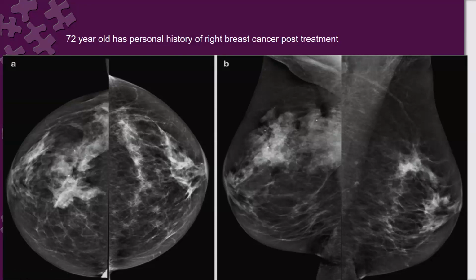Okay, this is the treated site. Okay, it is not on the treated site. This was operative or post-treatment changes. Is it easier now? It is not on the treatment site. This is a small lesion in the right image, posteriorly, a part of the treated side. Very small. Where exactly? Posterior where? You can localize, you can mention exactly where.